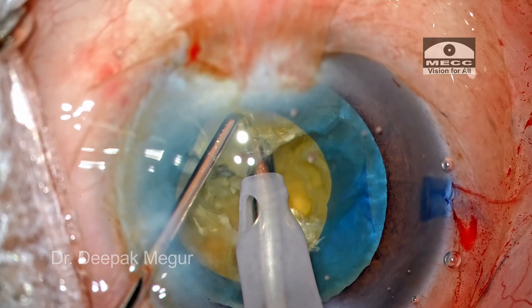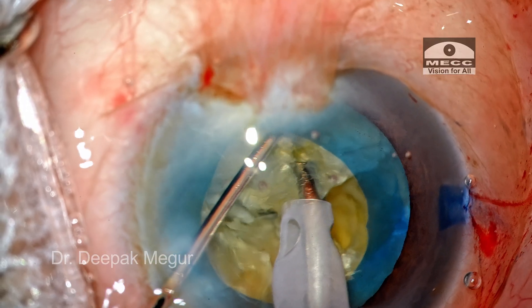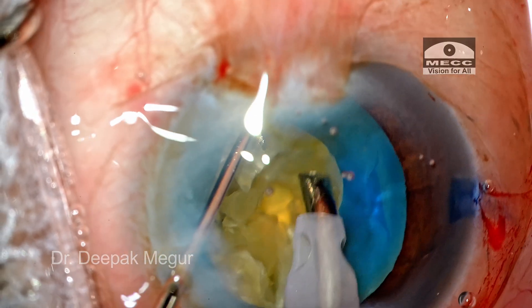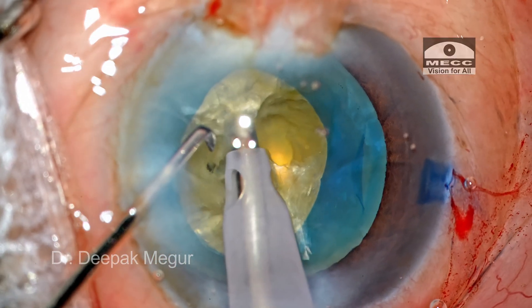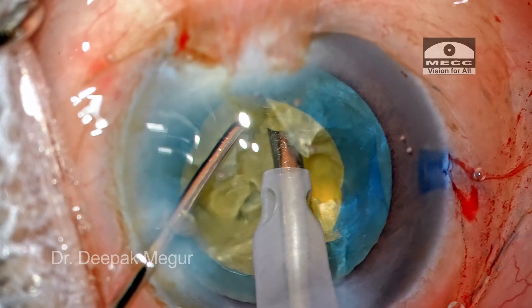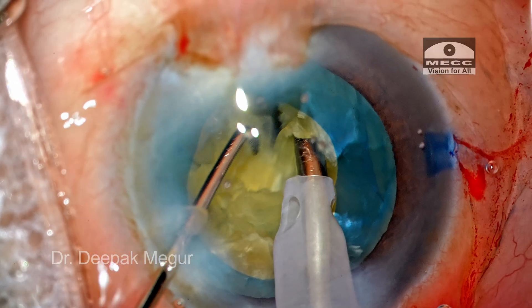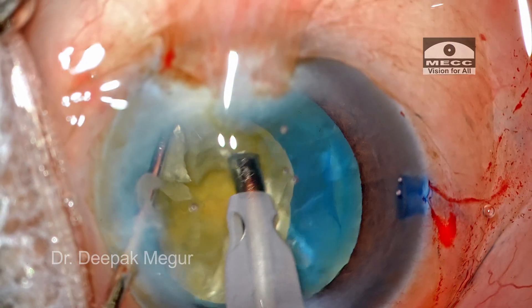The nucleus is rotated and the process of dividing the nucleus into smaller fragments is continued. We need to remember that the lateral separation maneuver has to be a little controlled because the lateral aspects of the edge of the rhexis are very near. When trying to aggressively perform lateral separation, there is always a risk of tugging at the rhexis margin, which can tear in these long-standing cataracts — we expect the capsules to be relatively friable. So one needs to be mindful and try to be as controlled as possible.